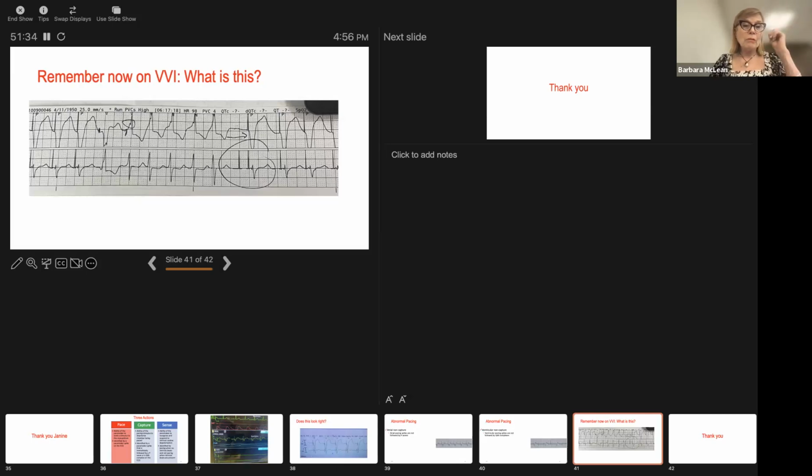So I, as the bedside nurse, number one, I'm going to be prepared to make sure that the electrolytes are stable, to be very aware of that now that the patient's on CRT, that I must be aware of my electrolyte balancing, and that I've got to really pay attention to that. But it also means that I'm going to assure that every nurse who takes care of that patient knows how to operate transcutaneous pacing, because if his permanent pacemaker is failing, you're going to have to apply transcutaneous pacing until we can get downstairs to the EP lab. So electrolyte balancing, transcutaneous pacing, when you have obvious pacemaker failure.